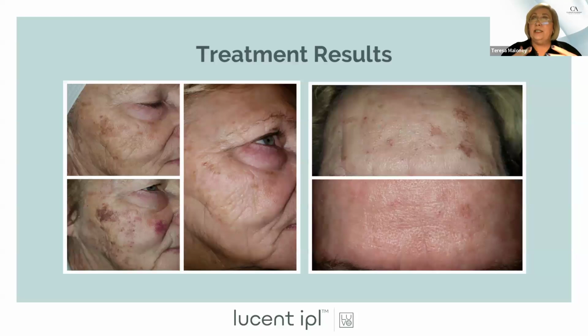One of the things that I do when I do these treatments, I always say, I could bruise you. There's potential that I'm going to bruise you, like I hit you kind of bruise. If I tell them that, I don't surprise them when they sit up. I think it's very important that we tell our patient, our client, these are the things that can happen. You're going to see the light reflected through your skin. I could bruise you. I'm going to light you up like the 4th of July. I'm going to make it look like you lost a wet coffee ground fight from me. But this way, they're prepared for what's going to happen. And the resolution of what she got, and she needs more treatments, but this is just one treatment, and we cleared a lot of it away.